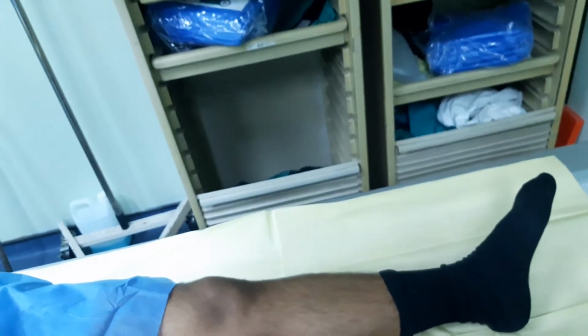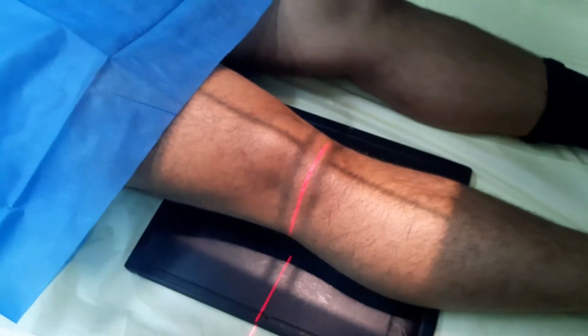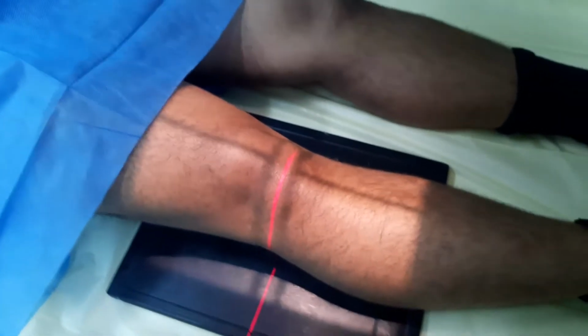So straightening back of the leg as you turn the tablet. Apex of the patella, right there. And you center to the middle of the leg. So that is the AP knee. And of course, for your collimation, you make sure you include the skin border on both sides, and you place your marker on the outside, lateral to the patella, which will be on this side, and you're good to go.